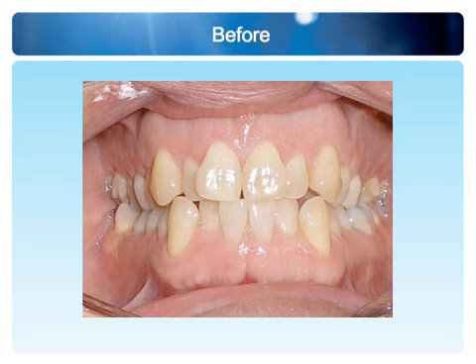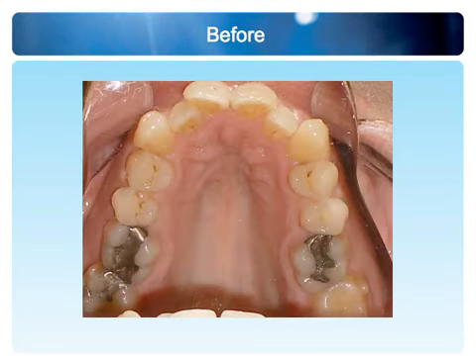So clearly, what you're looking at here is an omega-shaped arch. So let's take a look at it. The omega-shaped arch is characterized by upper second molars being placed much more to the buccal and almost in perfect position. They almost always occupy the right spot. But the first molars come in, and they come in heavy. So upper first molars are placed obviously to the lingual. And it sets up a perfect space here to measure a transverse measurement.